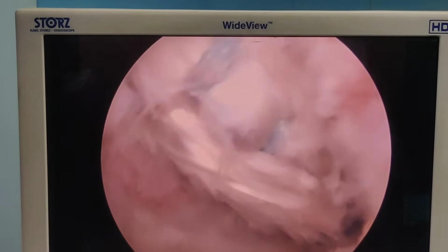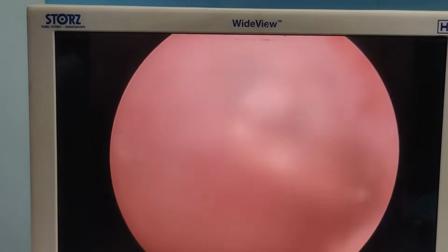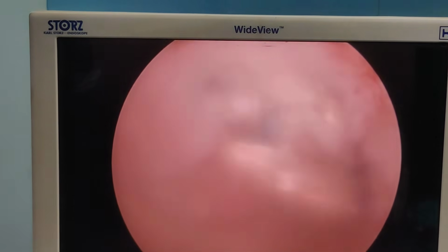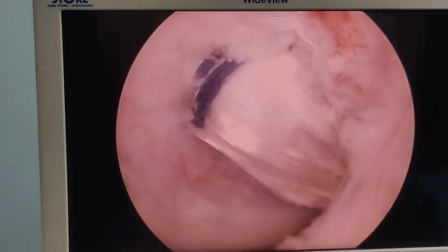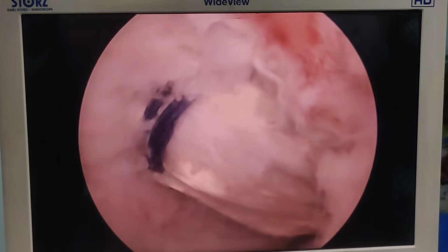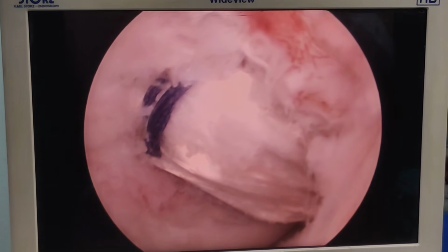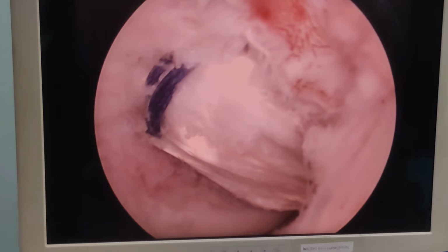So can you see this? This has beautifully gone into the femoral tunnel. Just let me give it a wash and I will show you better. So can you see this? This anterolateral bundle is beautifully recreated. So we now just need to flip on the outer side and then we need to fix the tibial side.